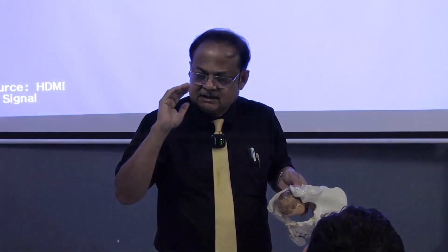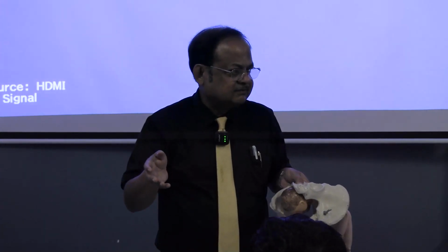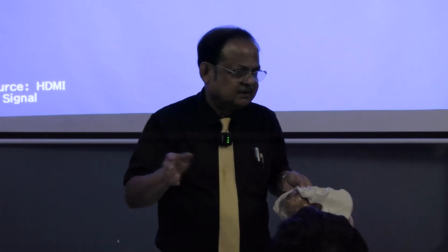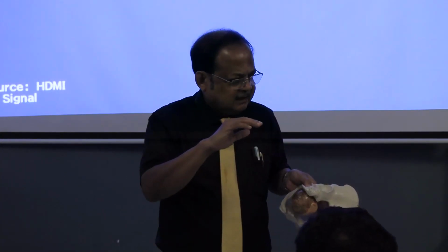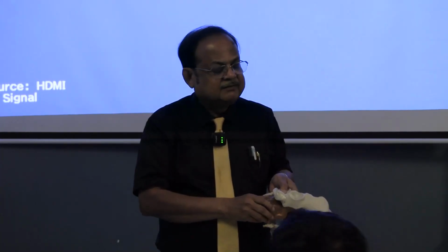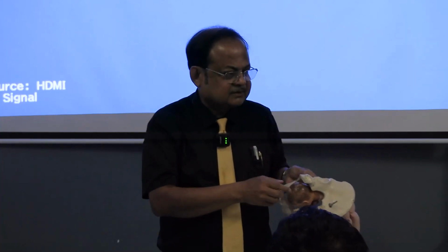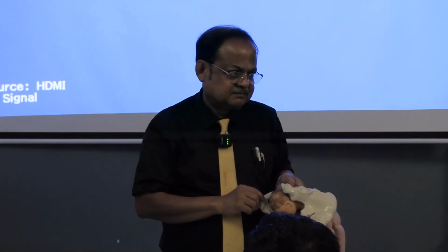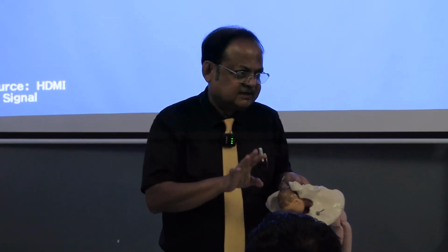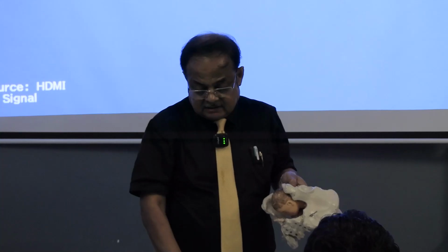Mid forceps is really difficult, especially if the rotation is not complete. So there are different types of application in case of mid forceps. Clear? Outlet forceps, mid forceps, and low forceps. But in all the cases, there may be rotation of the head. Even with the outlet forceps, you may have to rotate the head either with the hand or with the forceps. So these are the forceps classifications. This classification is for both the ventouse and the forceps.